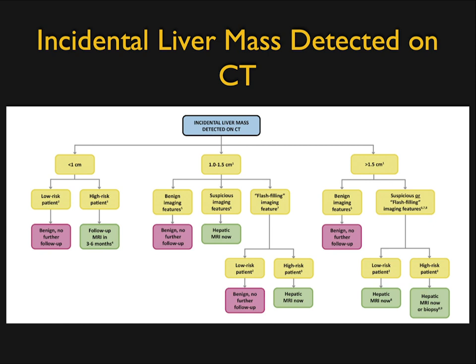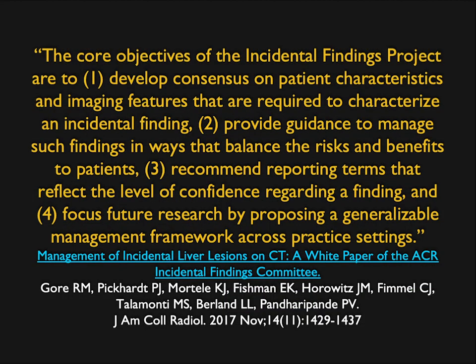Criteria, very much like pancreatic cysts, depend on size, depend on history, and depend on what features you can get. It does make the point that doing the study correctly makes it very easy. If you have a poor venous phase only, it's hard to figure out what the heck is going on. Now, in this incidental committee, of course, the goal was to try to figure out how to do the least invasive work on a patient and how to minimize additional studies.